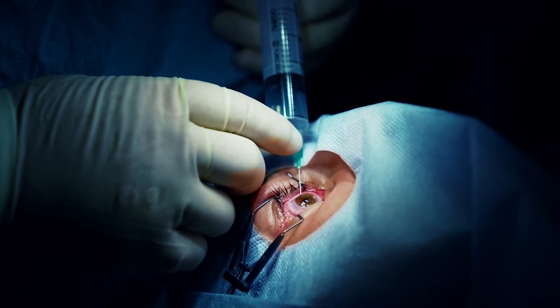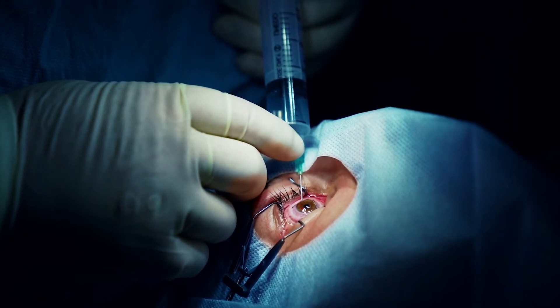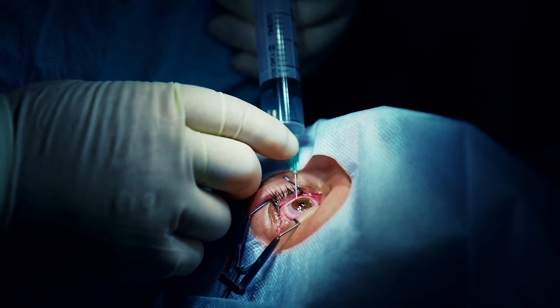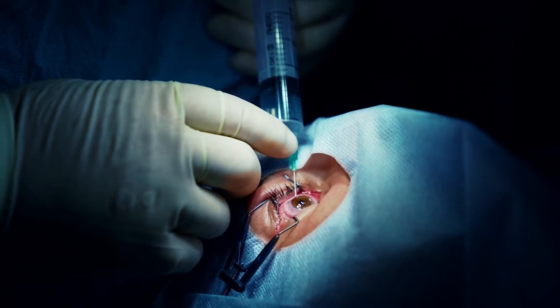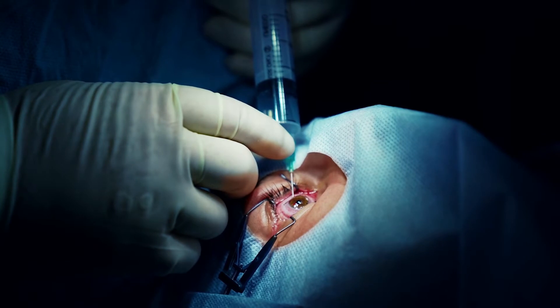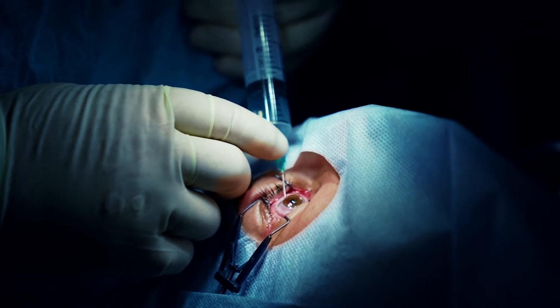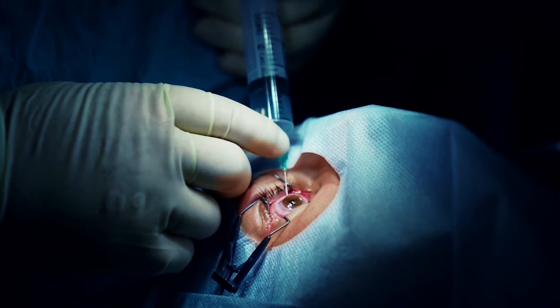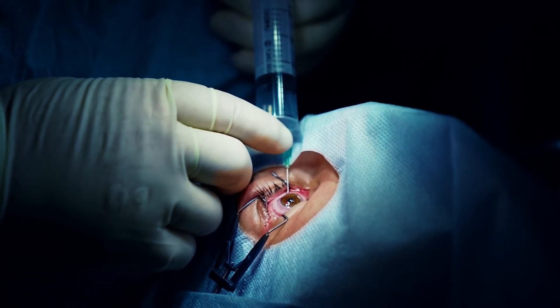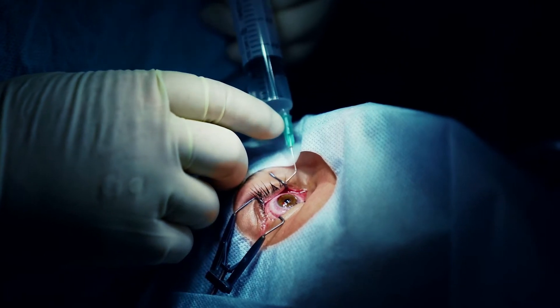Overexposure of the globe is often associated with increased pressure on the globe by the instruments used for eyelid retraction. All of these factors are associated with increased surgical complications during cataract surgery.